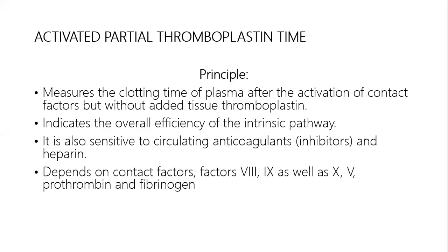Again, in PT we use thromboplastin. In APTT we don't. But the end product that we are looking for is the formation of clot, right?